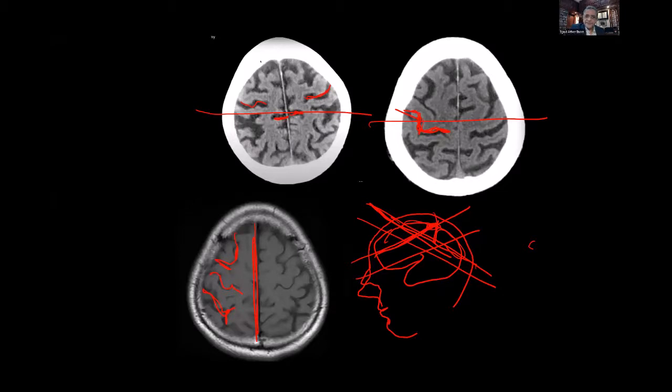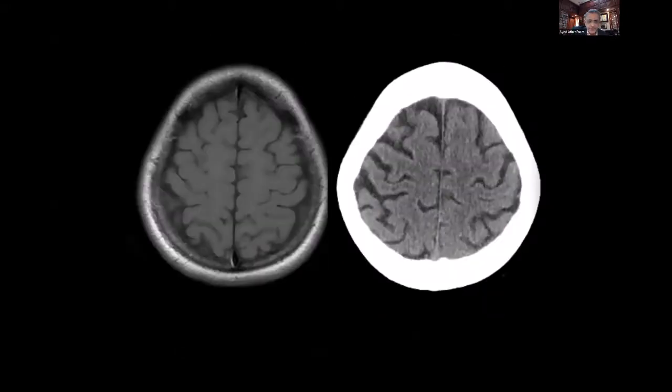Look for these signs. And here again, you see this division over here? This is the postcentral sulcus. And you see this? This is the pars marginalis coming from the medial side. Central sulcus is going to be anterior to that. Okay. Central sulcus. Now here, this pars marginalis is not so clear over here.